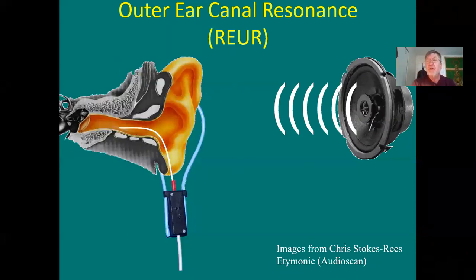The sounds can be twofold. They might be sweep tones. If they were sweep tones, they came out of the speaker in steps, in other words, 1/3 octave. Sometimes it's composite noise, and that contains all the different frequencies at once.